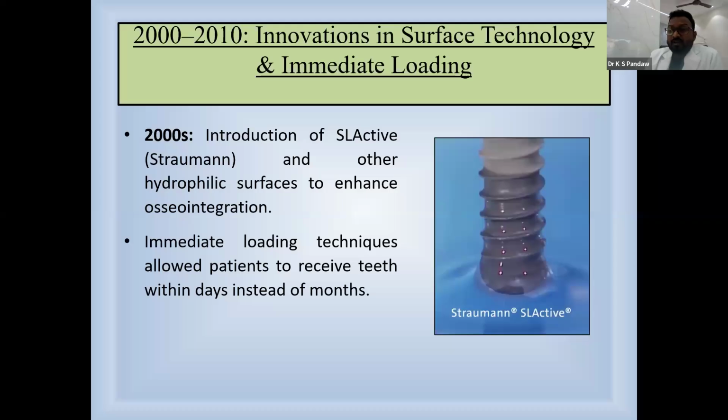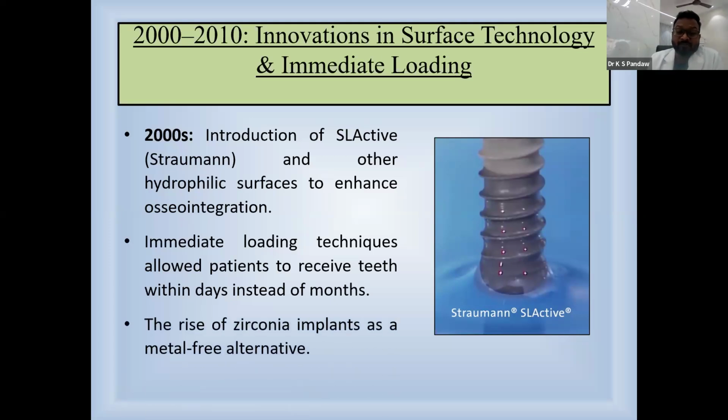Brånemark's technique involved delayed loading. Then we did much work on immediate loading techniques, which allow patients to receive teeth within a few days instead of months.